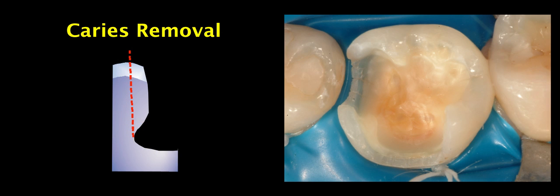Come to this clinical case: after caries removal and placing of the rubber dam we often face these undercuts. Of course we do not remove the tooth structure in order to eliminate the undercut but we have to fill in the undercuts. Instead of using calcium hydroxide or glass ionomer we prefer to adhesively reconstruct the abutment with the help of bonding agent and composite resin.